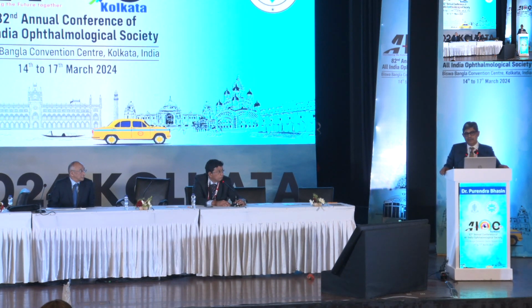No, I think it's a very pertinent question which you have raised. But if you have experience of doing phakic IOL, you can do it up to 2.75 or so. But I have not done it in less than that. And then you have to change the size of the lens with the Indian lenses, because the ICL doesn't come with less than 12.1 millimeter size of the lens. So I will say that it's better because you have to look at the lens rise also. And you have to see what kind of angle of anterior chamber the patient is having. So all these things are important.